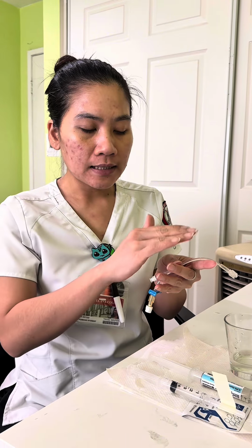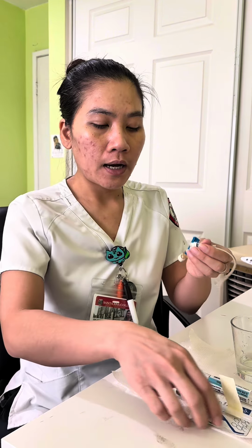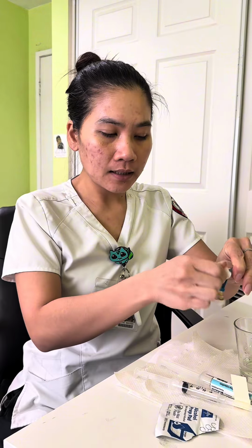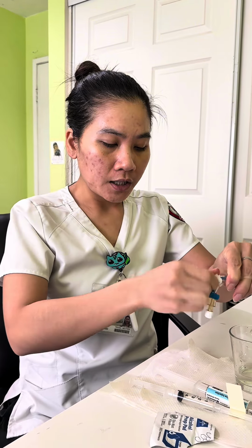I go ahead and assess the IV site to see any sign of swelling, redness, or discomfort. Everything looks normal. I go ahead and clean the port, and clean the site for 10 seconds, and then allow 10 seconds for it to dry.